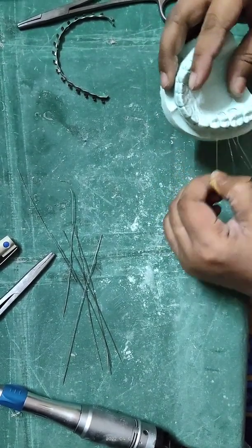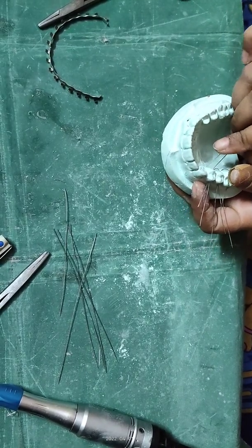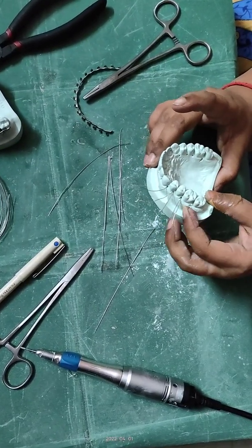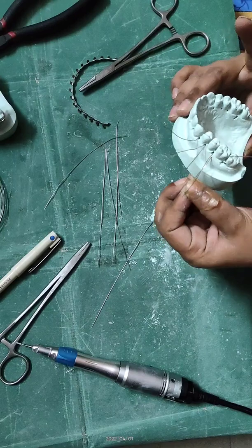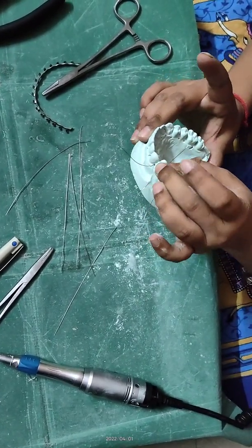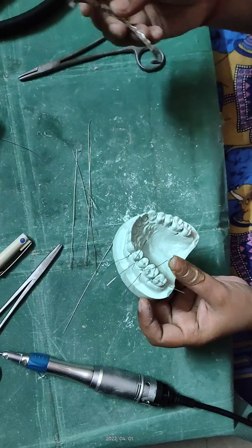Take the tension on the wire such that the distal side of the tooth has the wire placed occlusally and the mesial side is appropriately placed. Then take the arch bar.